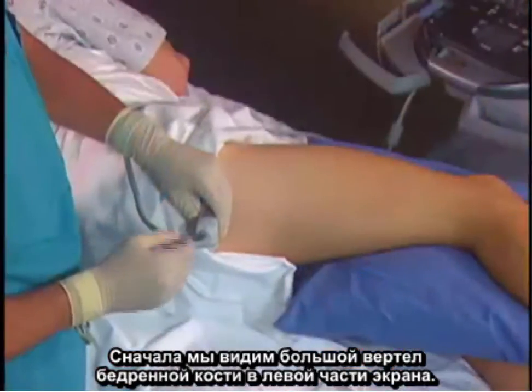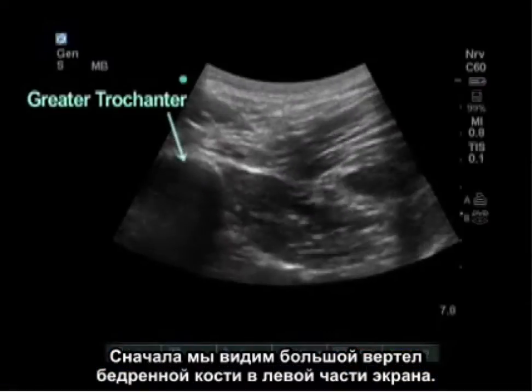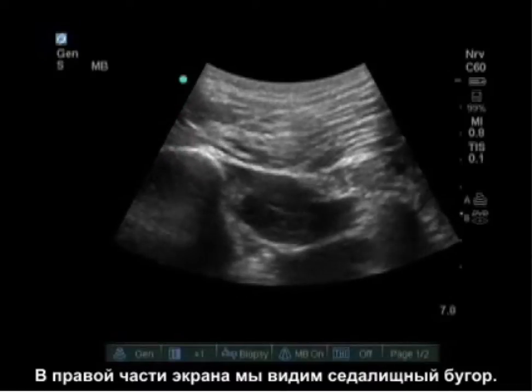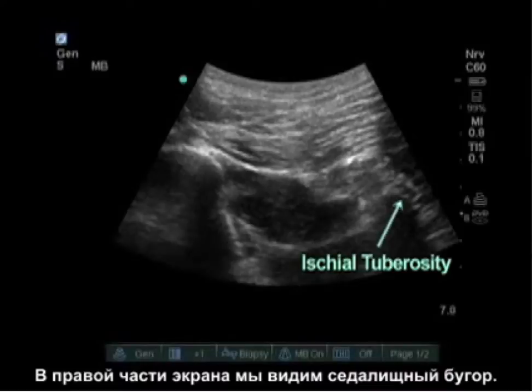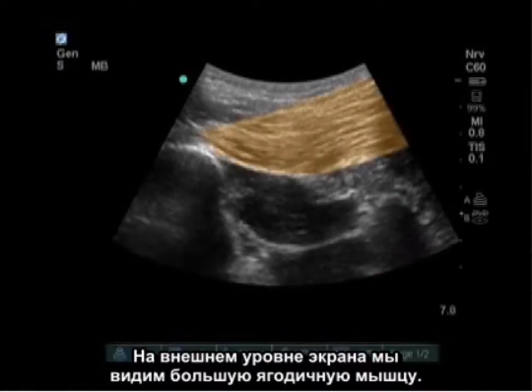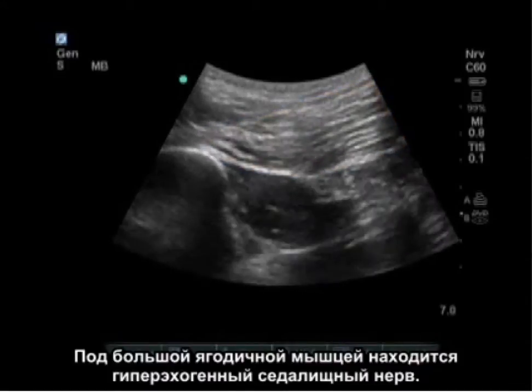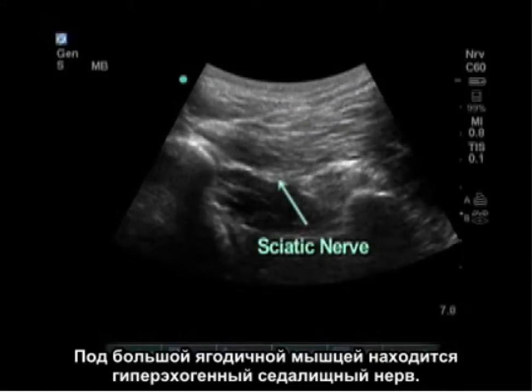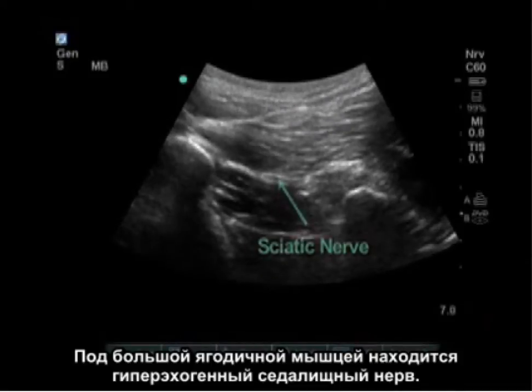The initial view we see is the greater trochanter on the left side of the screen. On the right side of the screen we see the ischial tuberosity. There is a large muscle, the gluteus maximus, at the superficial level of the screen. Underneath the gluteus maximus is a hyperechoic nerve, the sciatic nerve.